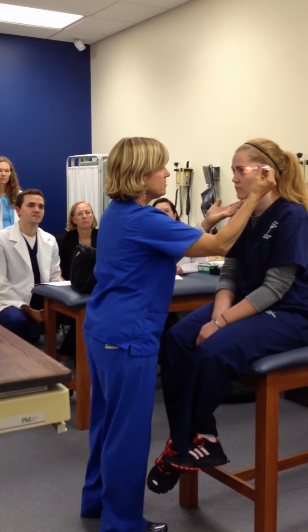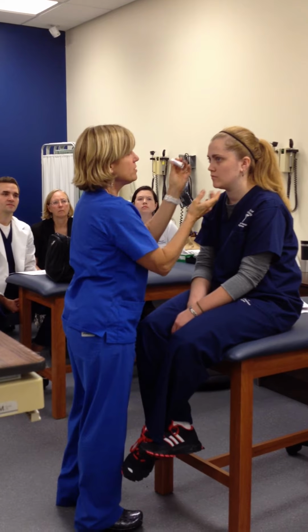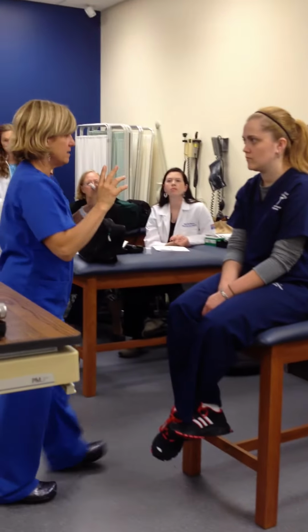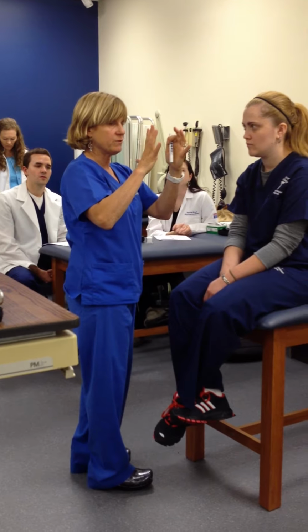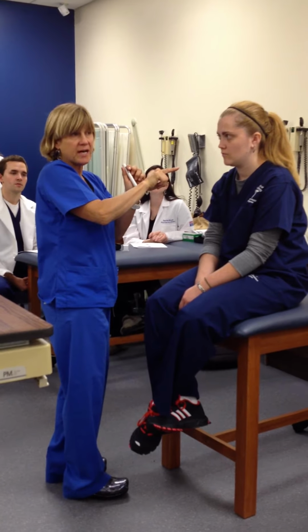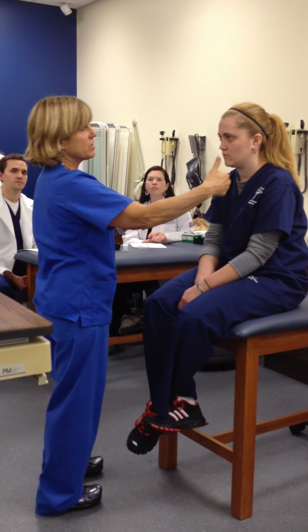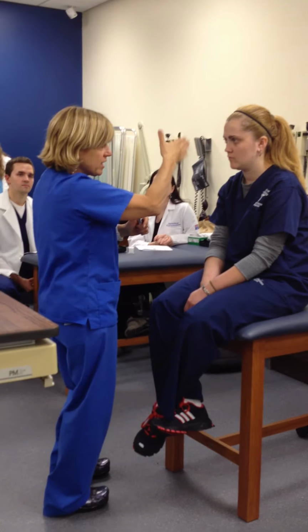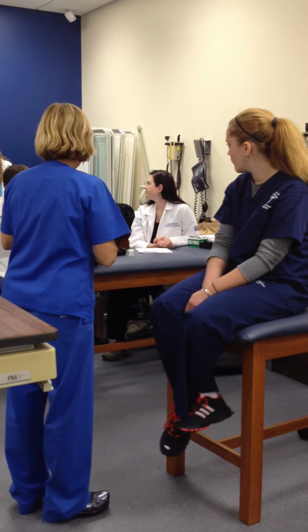So we're just going to shine this in your eye, and I'm going to shine this in your eye. And I'm noting if the anterior chamber depth appears normal. Remember, this is the one where, as you shine it through the anterior chamber, if the chamber was very shallow, it would cast a shadow on the nasal side on that particular eye. And if we went to the other eye and that one was narrow, it would shine the shadow on that other side. Is the shadow always on the iris?